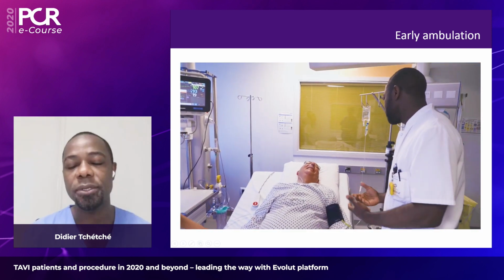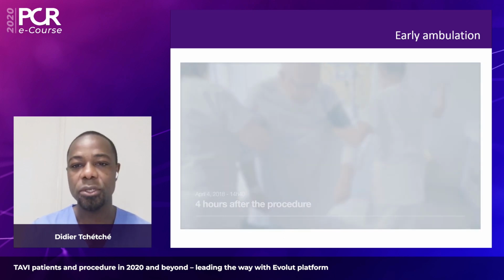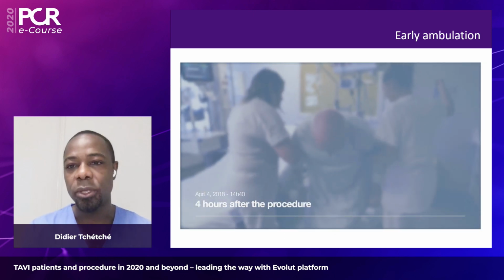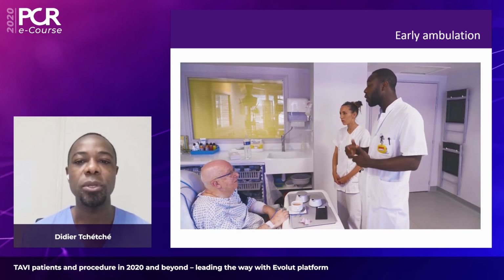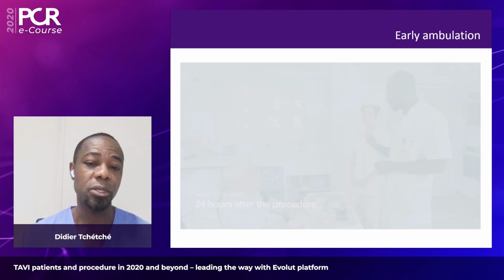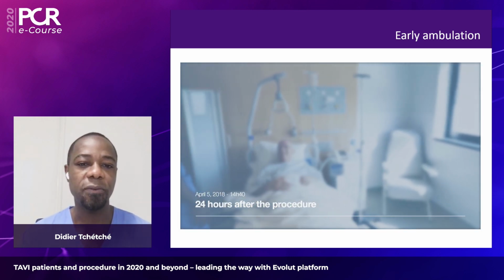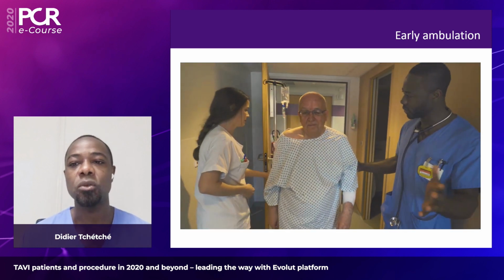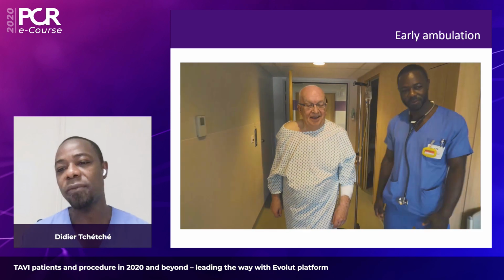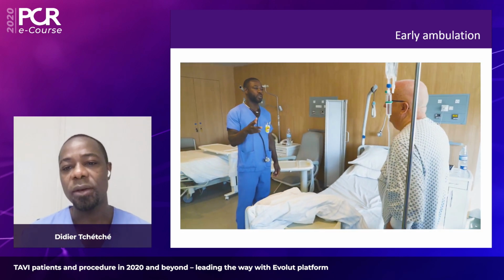We've seen the importance of major vascular complication prevention and conduction disturbances prevention, but it's also important, particularly in the frail and elderly population, to make sure that we have early ambulation. What we promote in Toulouse is patients standing up 4 hours after the procedure and walking the day after, to make sure that we can safely have them going back home day 2 or day 3 after the procedure.